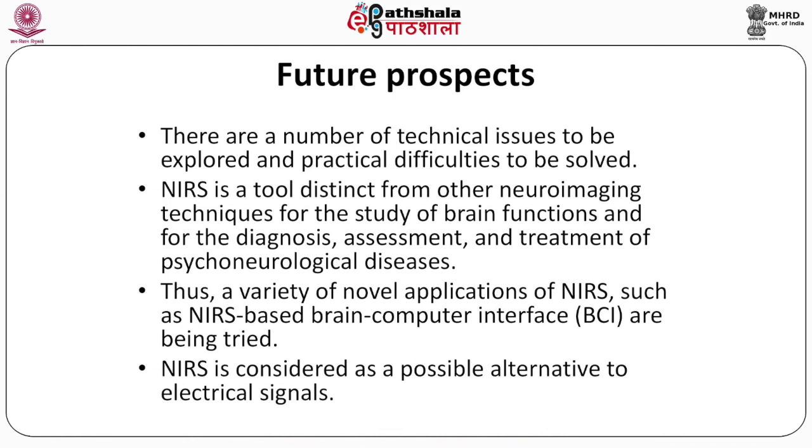Thus, a variety of novel applications of NIRS such as NIRS based brain computer interface are being tried. This is currently an area of research for the development of new functional near infrared spectroscopy techniques. NIRS is considered as a possible alternative to even the electrical signals because it is least harmful for the body.